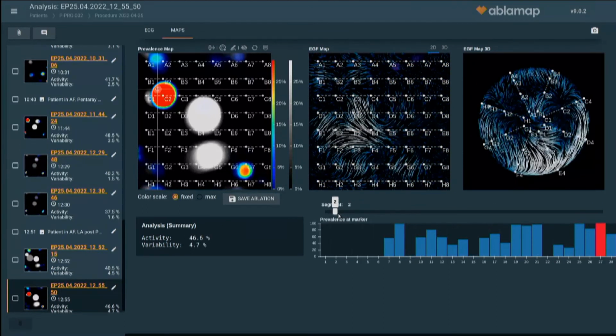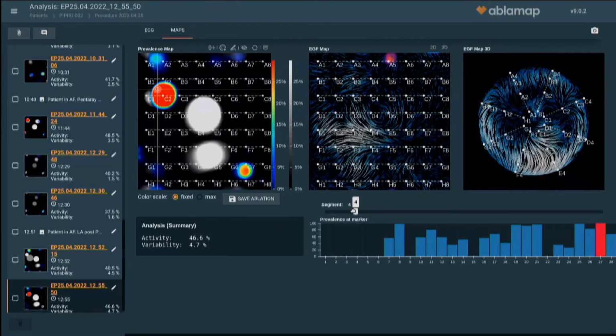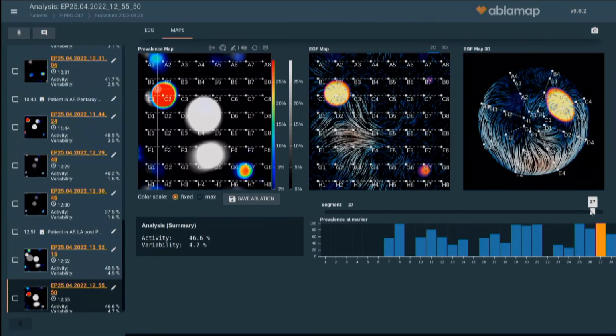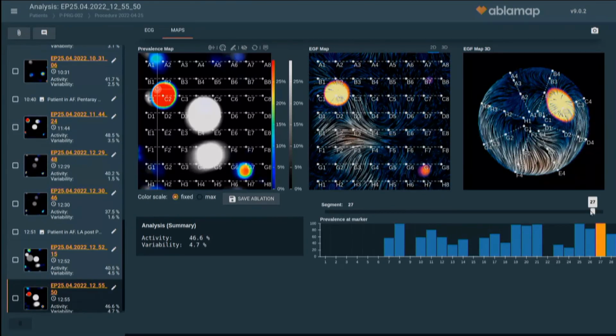Any questions? So, Toshi is actually ablating there right now, just trying to cover this region. We're getting good impedance falls? They're okay.